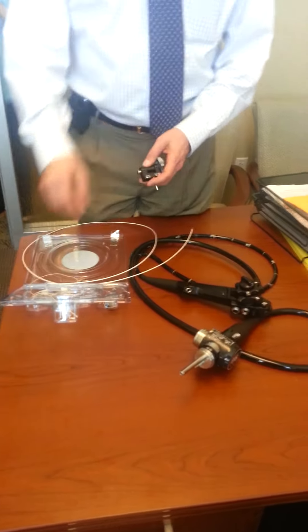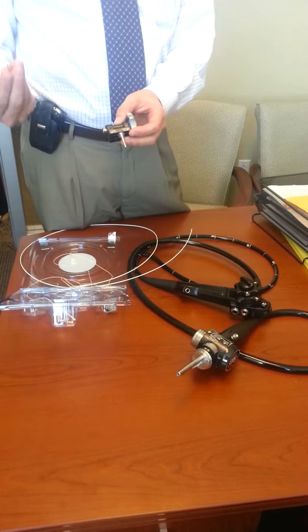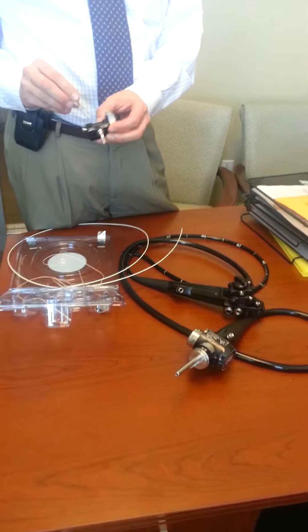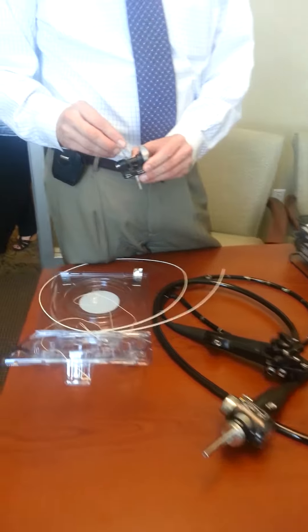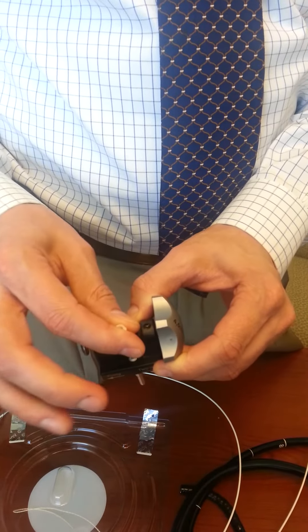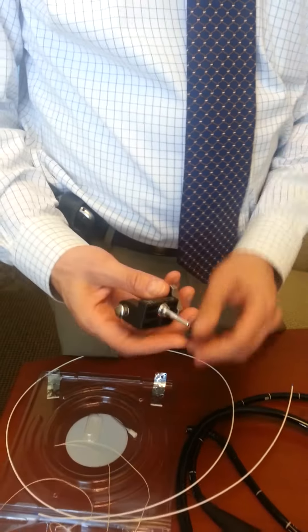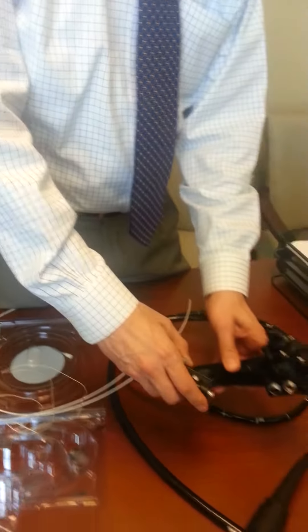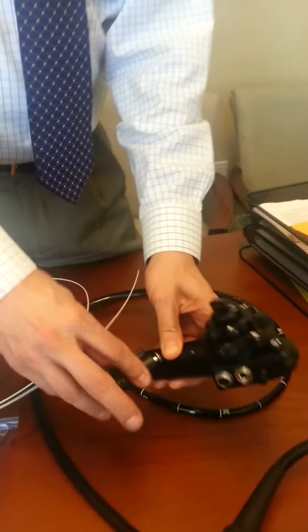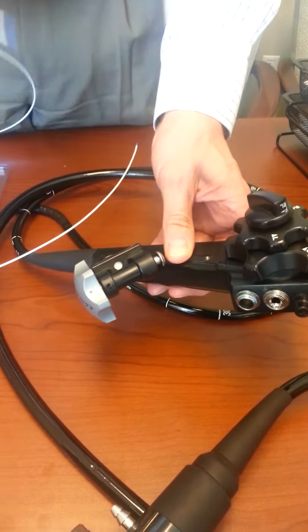The first step is to take the pledget and put it through the white diaphragm here, break that, and then load the spool into the scope through the suction port.